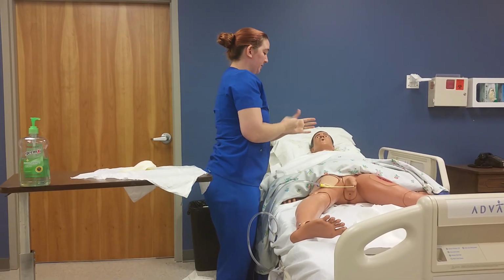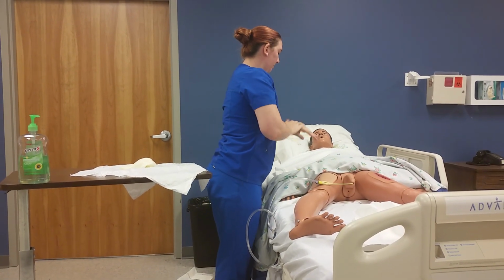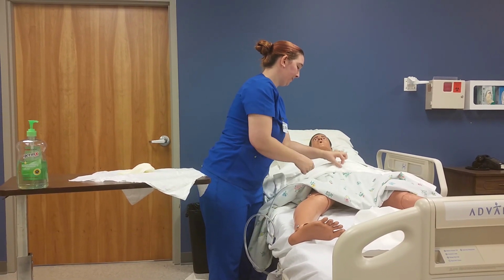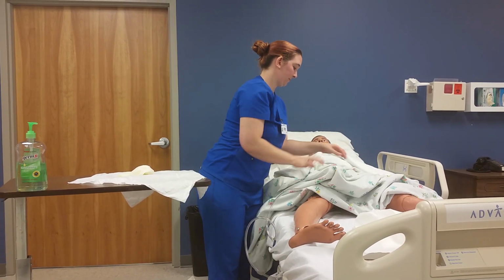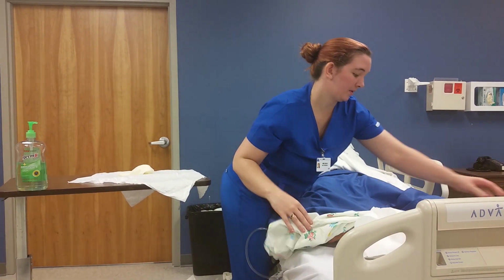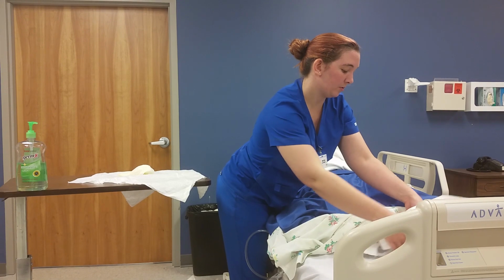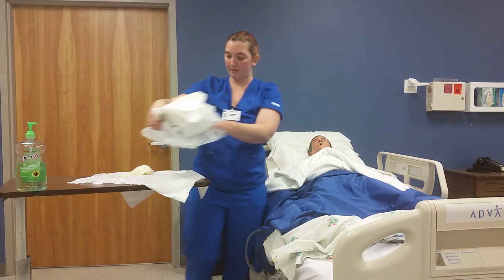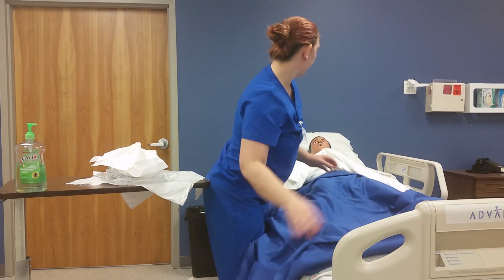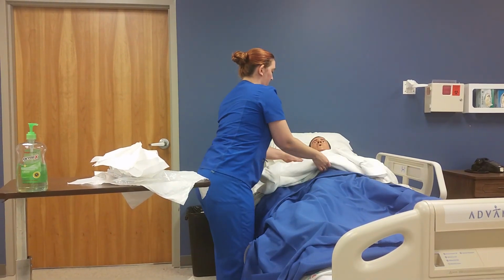I'm going to make sure my patient's not in any pain or discomfort. I'm going to cover him back up. We're going to remove all of our junk from the end of the bed that would be in the garbage. Pull his blankets down. Remove this one.